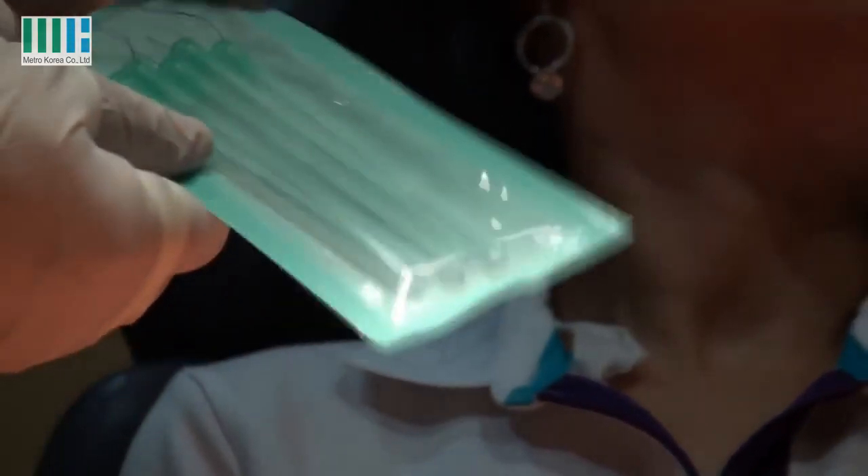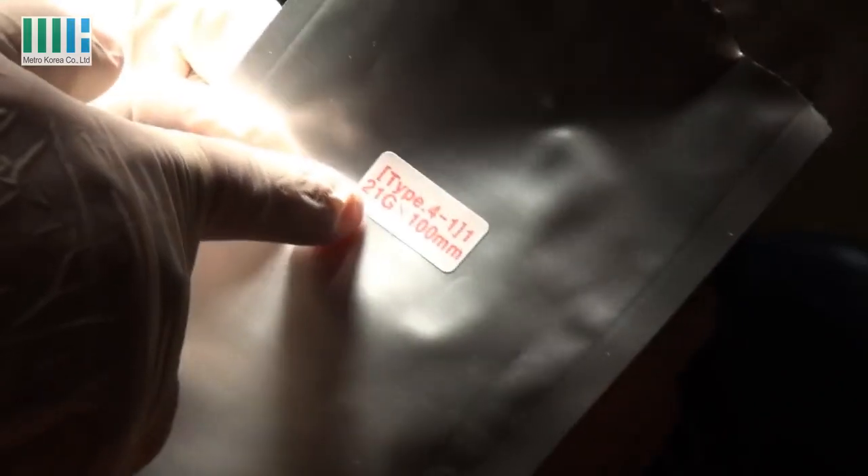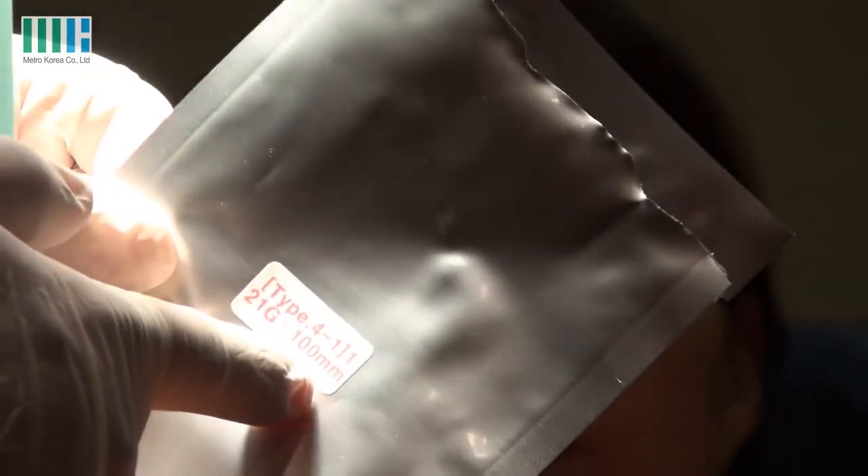The cog thread is big and long. Before we use this, I inject lidocaine to this point, and I have to find the cog. It is labeled 21G and 100mm.